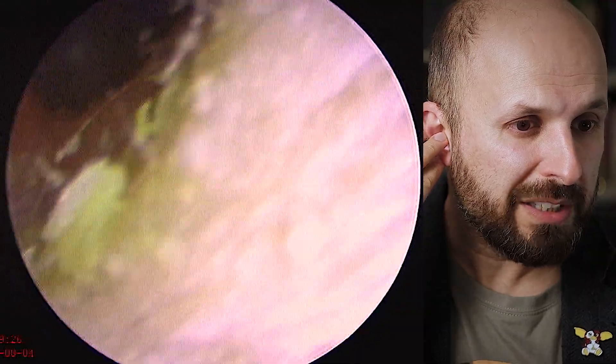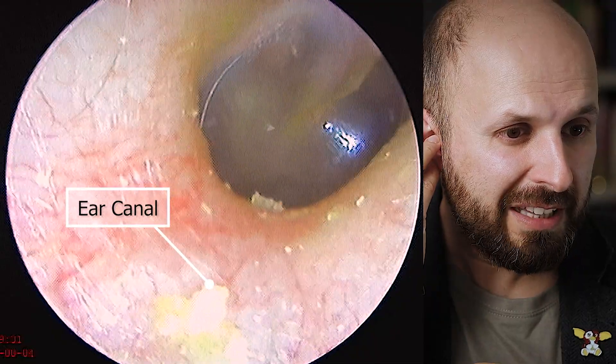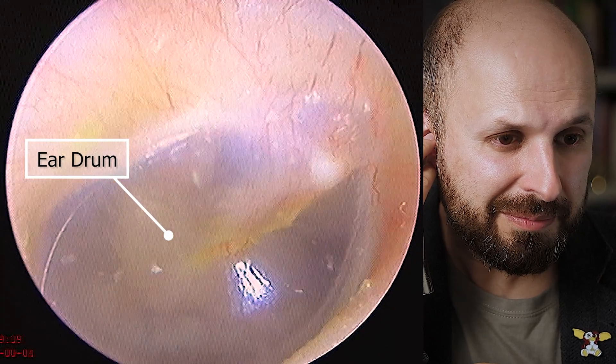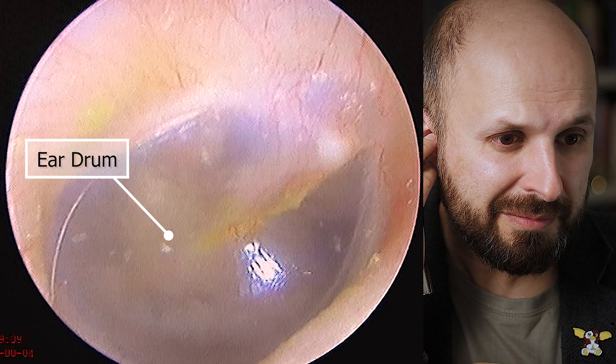You can see a little bit of wax on the outside — that's all entirely normal. You can see that looks a bit red there, but actually that's all right. And up here is my eardrum. The eardrum is just a membrane separating the outside world from a cavity behind the eardrum that we call the middle ear.